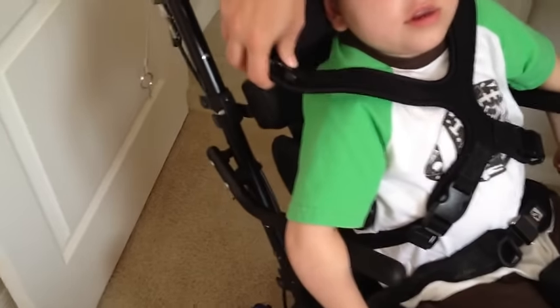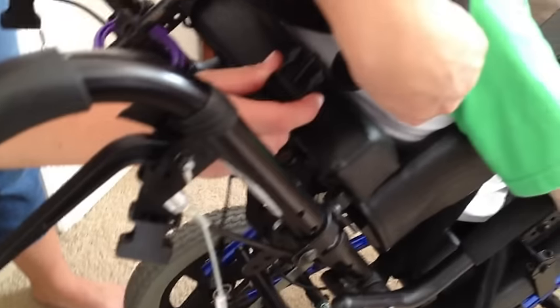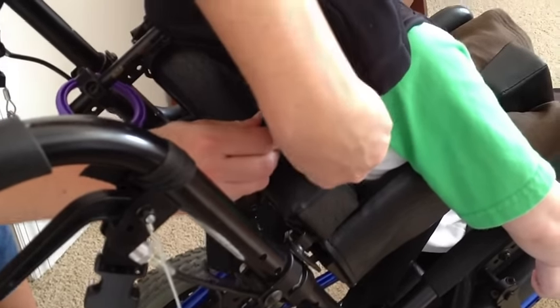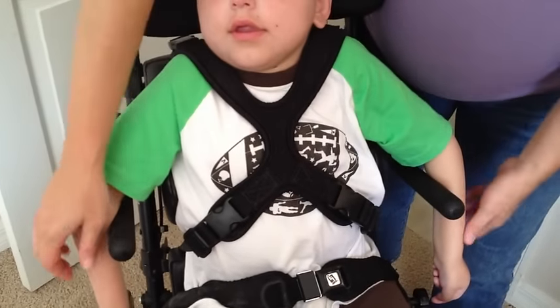Then you're going to want to go around the back, over his shoulder and under the headrest, and find the last piece in the back — that piece is also going to buckle in. Then you're going to want to come back to the front and just make sure it looks nice and tight and snug.